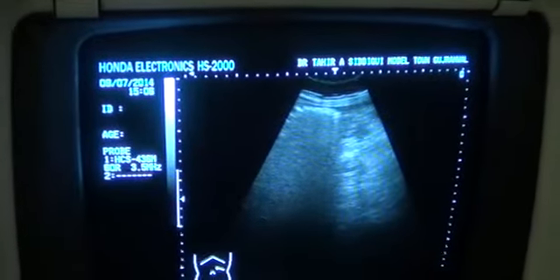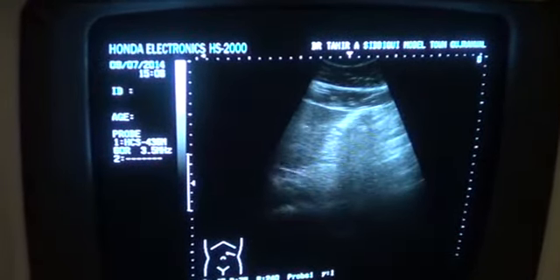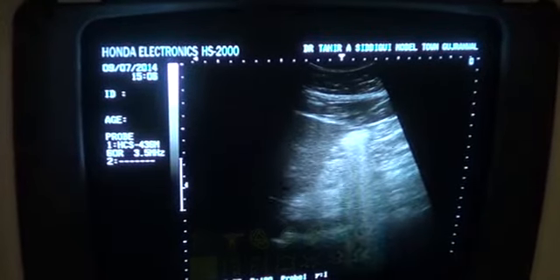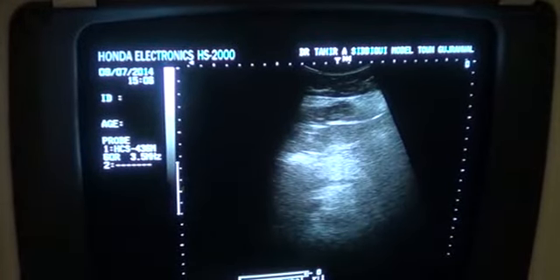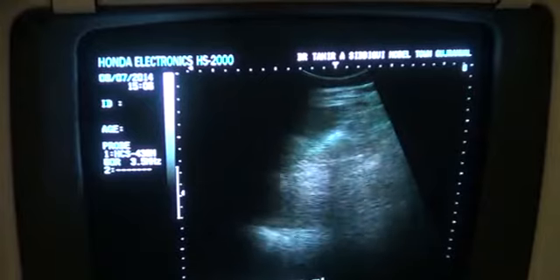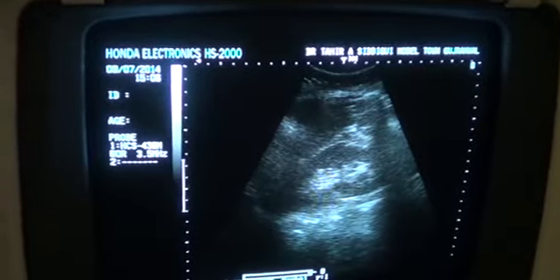Well, this is an ultrasound study of a 40-year-old female presenting with a history of unexplained anemia, and no ultrasound has so far been performed, nor has one been advised to her. Only transfusions are being given. There is no para-aortic lymph node enlargement, and the spleen is also normal in size. Kidneys are normal, both kidneys are normal.